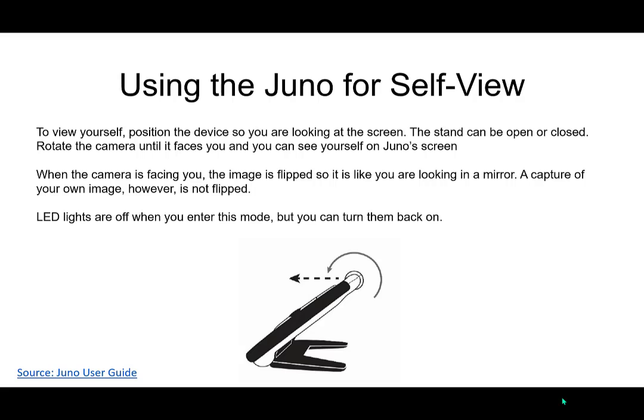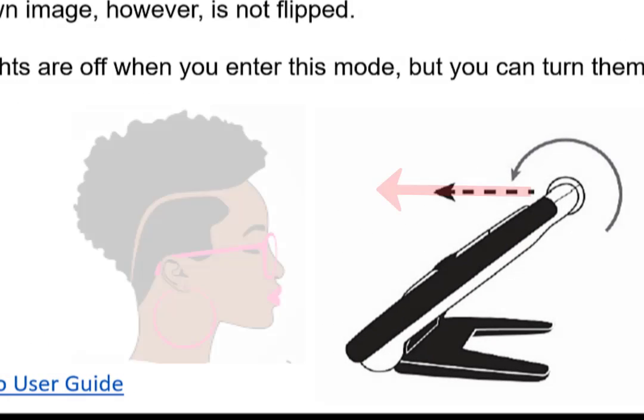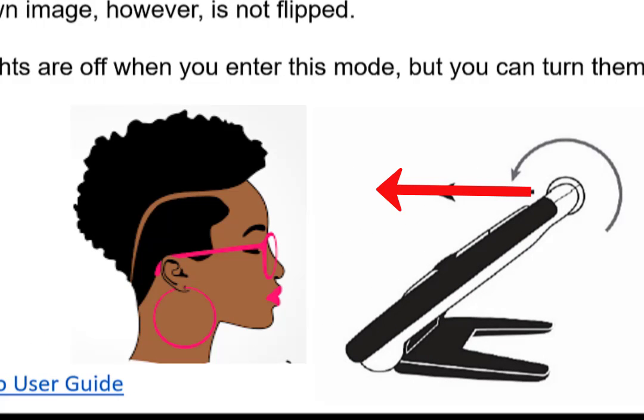You can use the Juno for self-view, and we all know that every single one of our kids is going to grab that thing and roll that barrel towards them and make a funny face in that camera, and that's perfectly fine. It's a good way of introducing them to the idea that can happen and telling them, hey, you can use this for functional things like putting on makeup or shaving or whatever floats your boat. You're going to be able to do that.